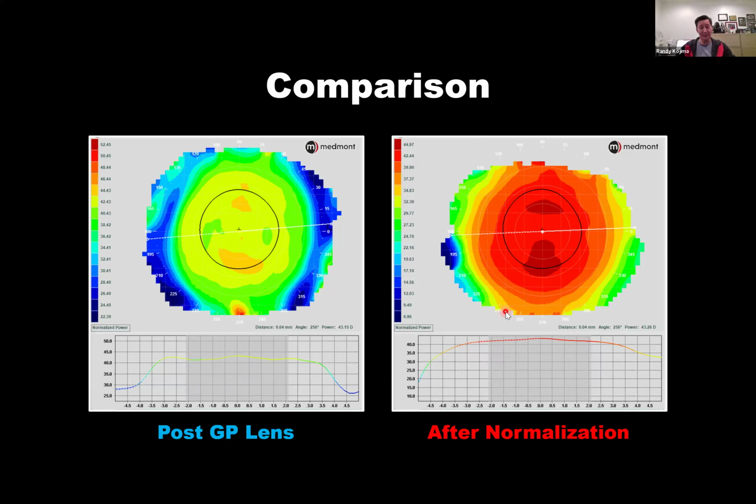And every month I would do another map and see if the eye had come back to a more prolate shape. And it was like 8 months for one sister and 11 months for the other sister before the eye looked like it was very close to normal again.